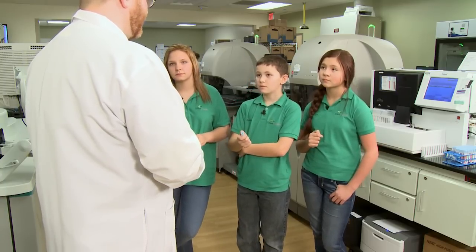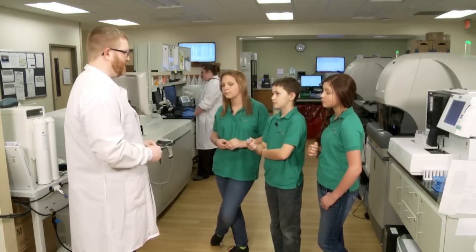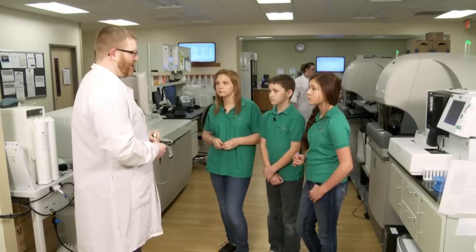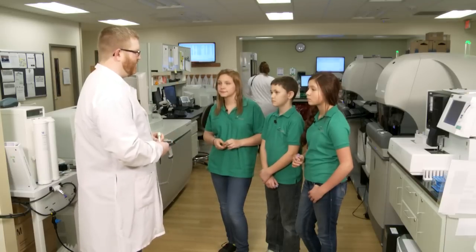Other tests can take 15 or 20 minutes to run and it takes a little longer to get the results. And there are some tests that we don't run here that the doctors might order — we have to send those tubes to another lab somewhere else and those can take a couple of days. What would you do if someone was at life risk and it took a really long time? We have a department called Blood Bank where we store blood that's been donated for emergencies when people have an accident and are bleeding a lot. In an emergency we're able to give blood to the doctor while the test is going on.